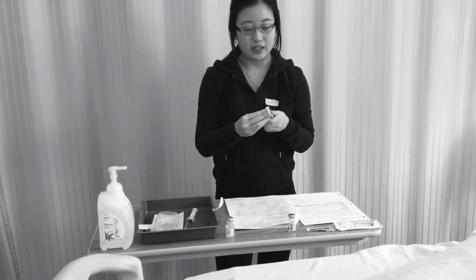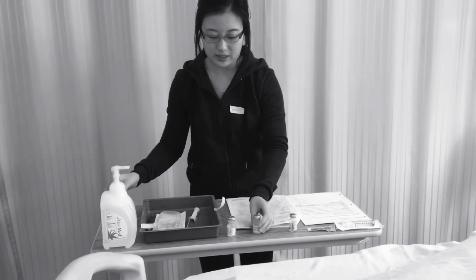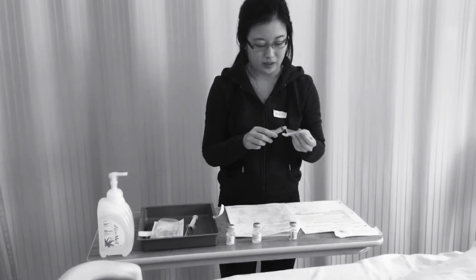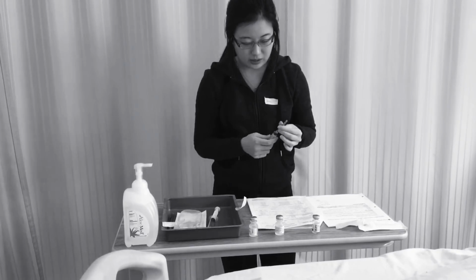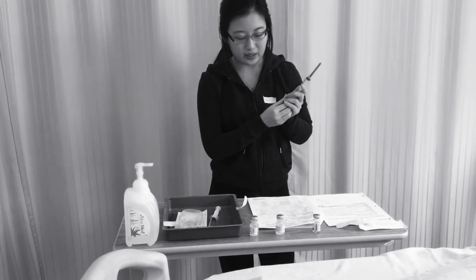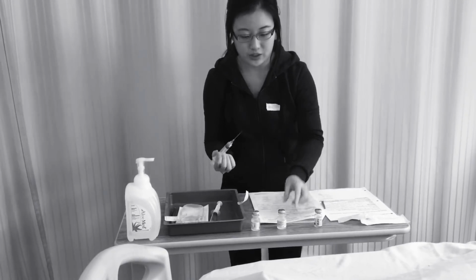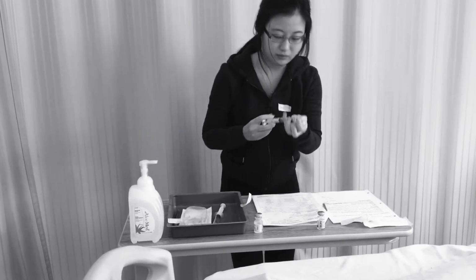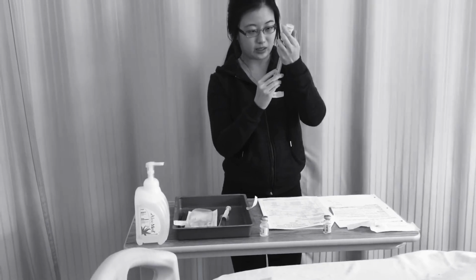for 30 seconds. For the purposes of this video, I'm going to assume that 30 seconds has passed, and I'm going to let that dry, and I'm going to put my syringe together. So I'm going to draw 1.8 ml of air. And now that it's dry, I'm going to put this in. I'm going to take out 1.8.